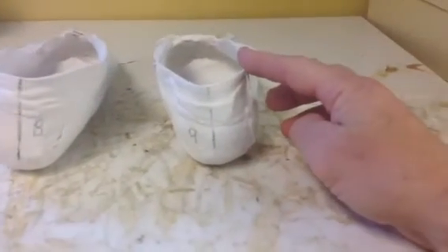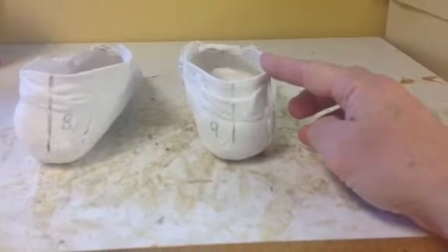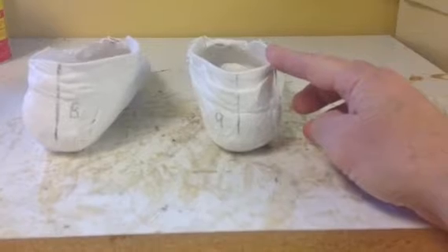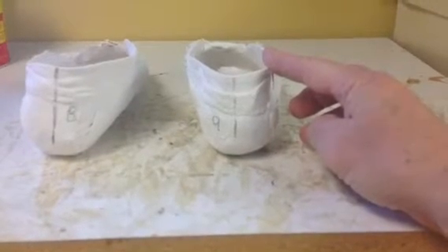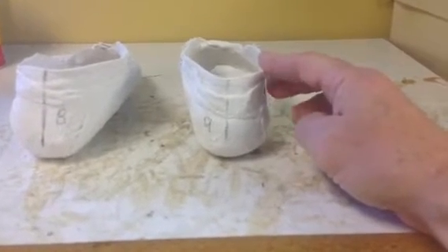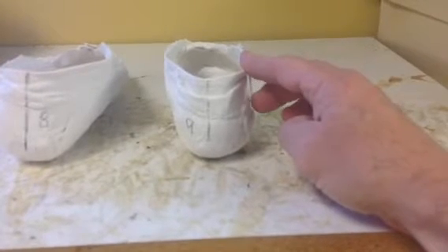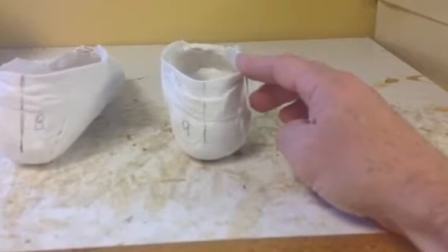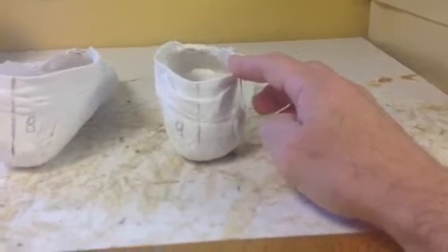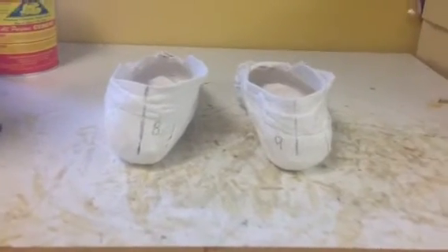When I take the cast, I take it in a neutral suspension root balance technique. The subtalar joint is in neutral, and the midtarsal joint is maximally pronated. Then I place the cast on the table after bisecting the heel, and the bisection of the heel parallels the lateral border of the cast. That's the lateral border of the calcaneus. So we bisect the center of the heel and then place it on the ground.